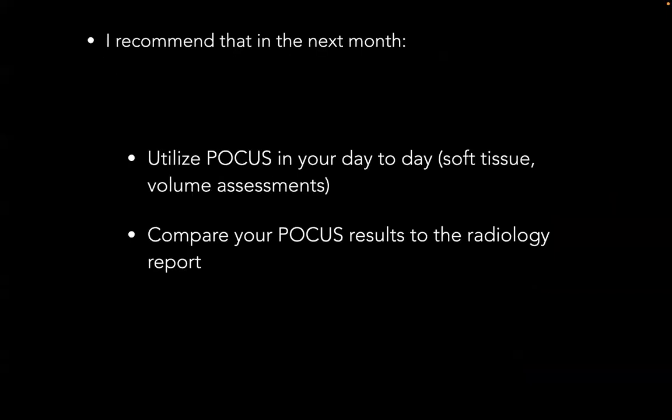Okay, so now that we're done with these few topics, I recommend that in the next month, I hope you can utilize POCUS in your day-to-day to scan your patients with any soft tissue concern, and also in your patients with a need for volume assessments. And then in the patients that you do obtain a radiology scan, compare your own POCUS results to that report.